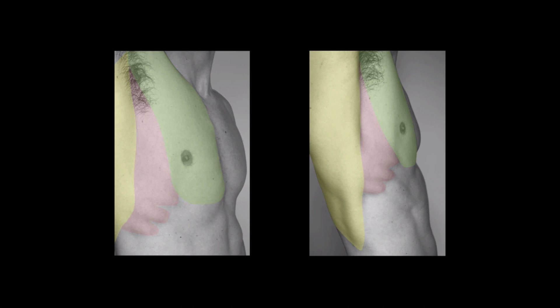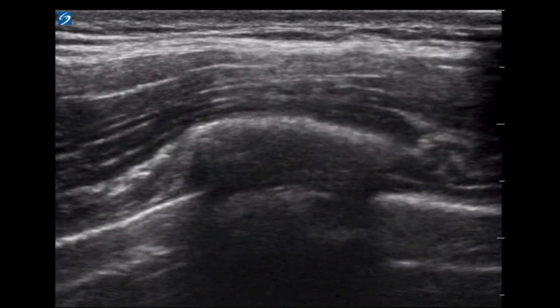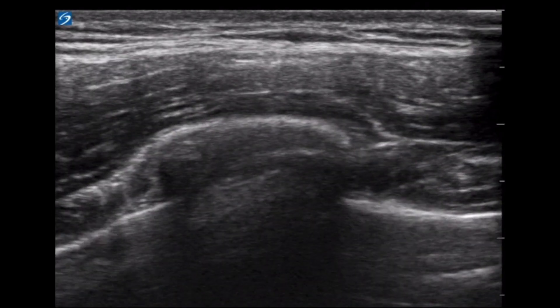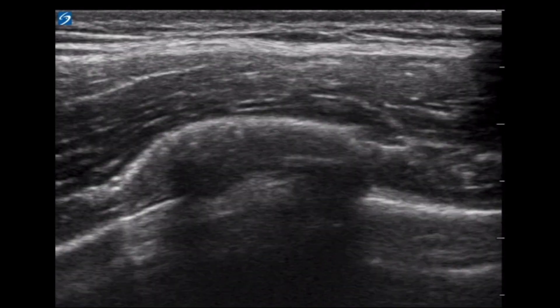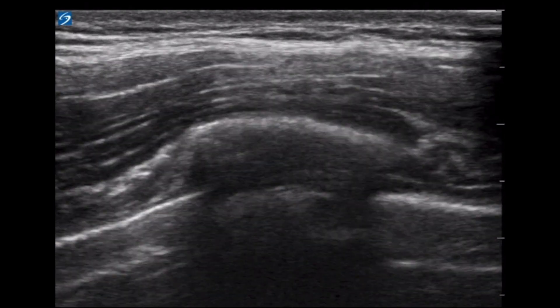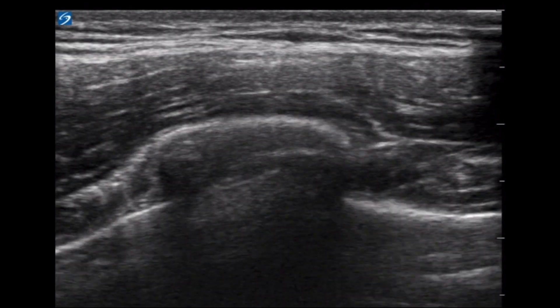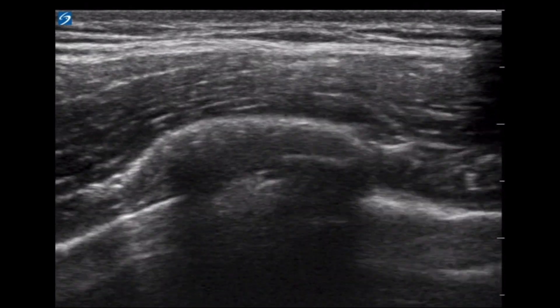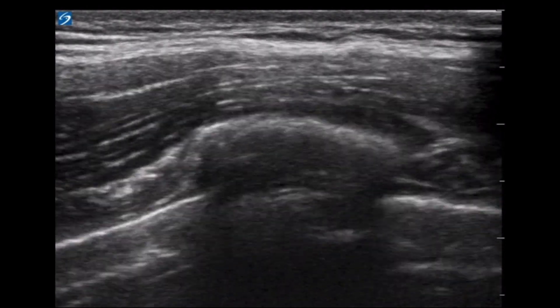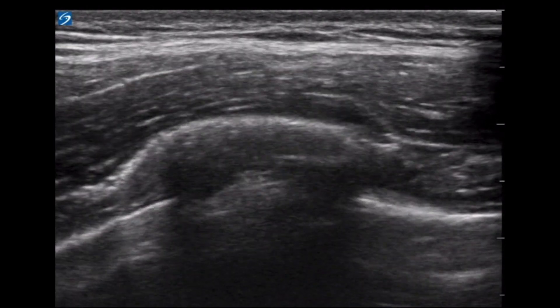In these pictures, the latissimus dorsi is in yellow, the serratus muscle is in red, and the pectoralis is in green. For identification of anatomy, a high-frequency linear probe is positioned at the nipple line in a male or the inframammary fold in a female. Here is an ultrasound in the region depicted in the previous slide. Take a moment and attempt to identify the important structures for this block. While you may not have performed this block before, I'm willing to bet many of you have performed an extended FAST examination, which should help with anatomy appreciation.